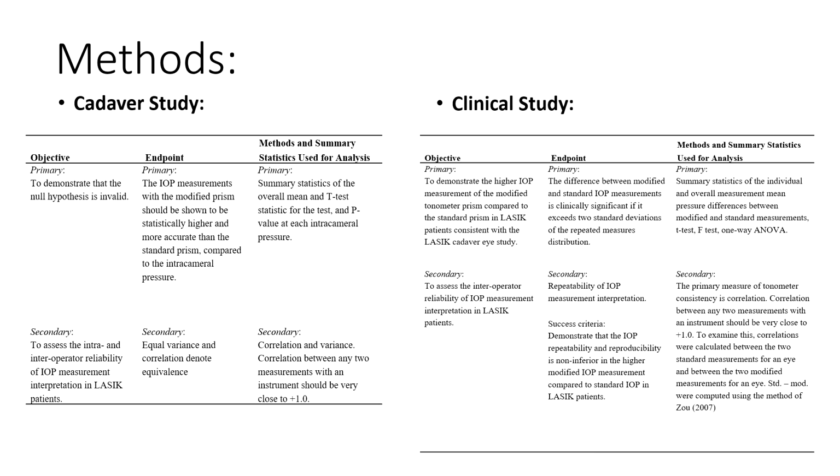1. As intracameral pressure is not a feasible option in live LASIK subjects, a LASIK cadaver eye study comparing a true standard intracameral pressure to both the standard and modified prism measurements was designed. 2. A clinical study across representative myopic LASIK patients was used to validate the cadaver findings, to demonstrate a similar difference between standard and modified prism pressure measurements as was found in the cadaver study.